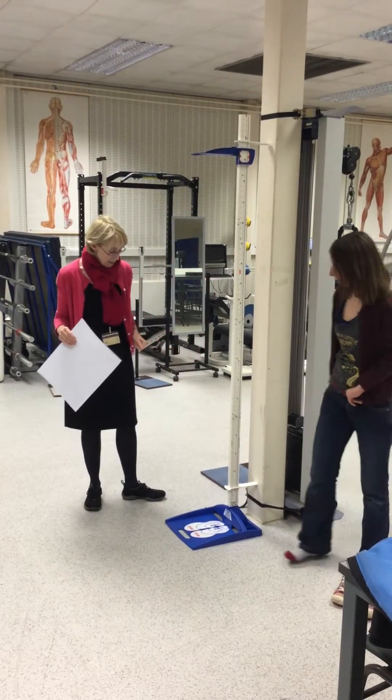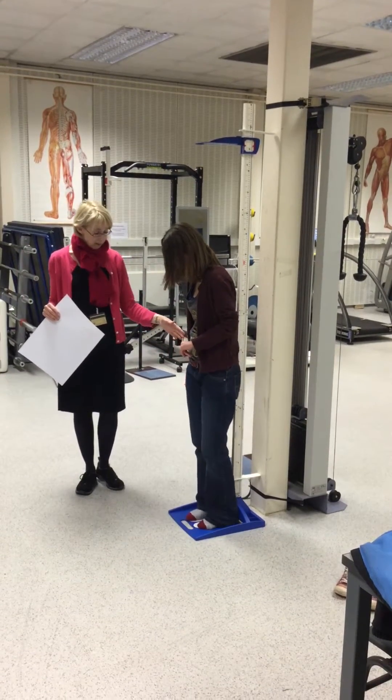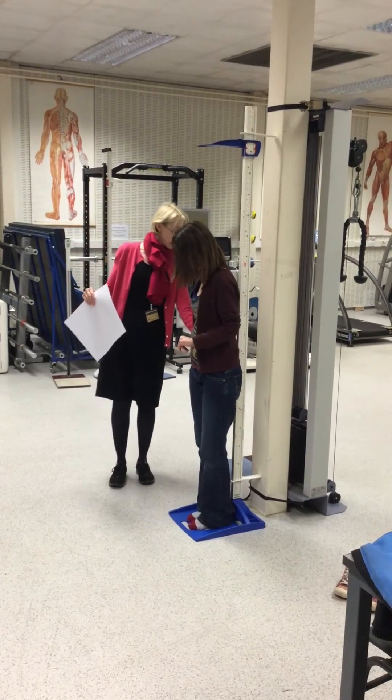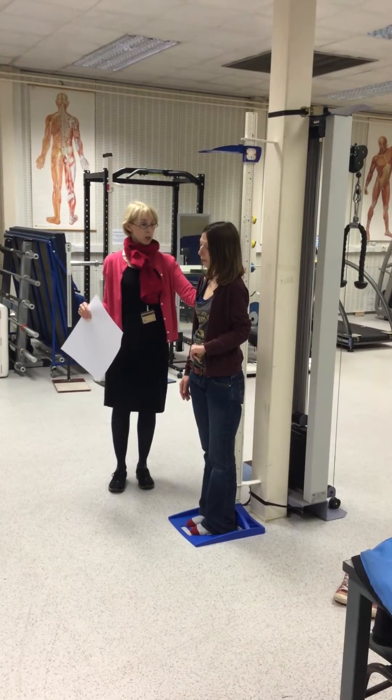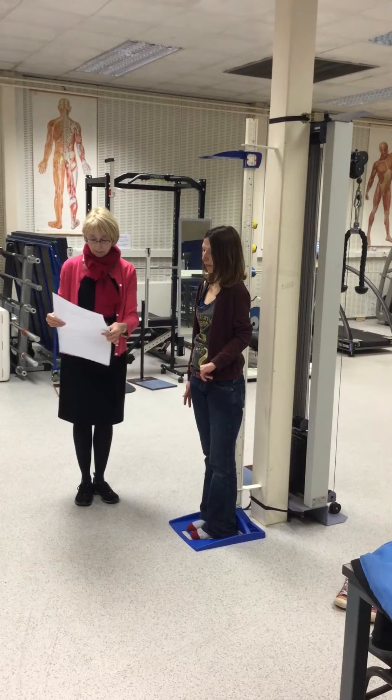So Lee, would you like to come and step on the plate? The instructions are to stand with the heels at the back of the plate, with the buttocks touching the rod, and also the shoulders. The arms hanging nicely by the side.